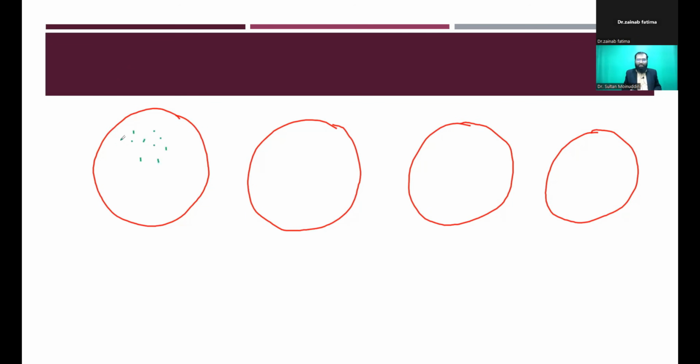Fine moving echoes. So if you see that there is a cyst, and the patient is having pain, the first time, doesn't have it with every menses, the pain is happening for the first time, or intermittent pain, and there are fine moving echoes in this, what does this denote? This denotes there is acute blood. So fine moving echoes favor acute blood. So this can be one appearance of a hemorrhagic cyst, where you can just see fine moving echoes.